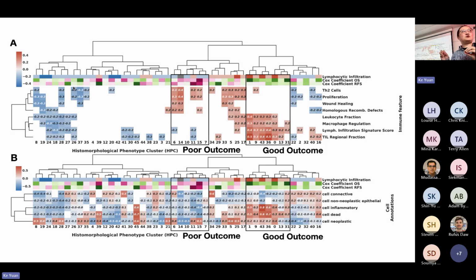So we actually use a very high-level view of the image. We used a magnification that is actually quite low. It's 5x magnification. So in each one of our tiles, we can see quite diverse information of tissue architecture. Yes, so something like 5, close to 5.